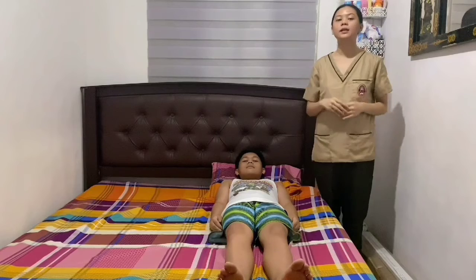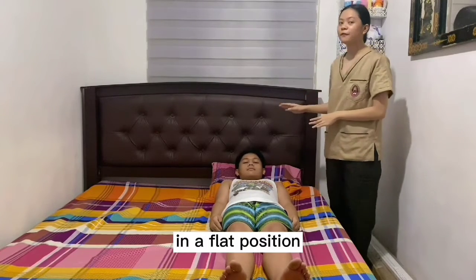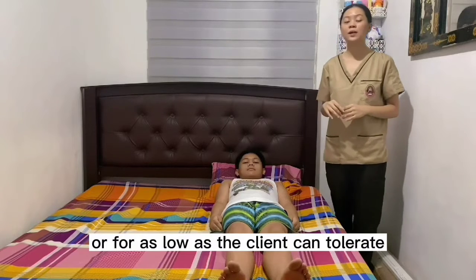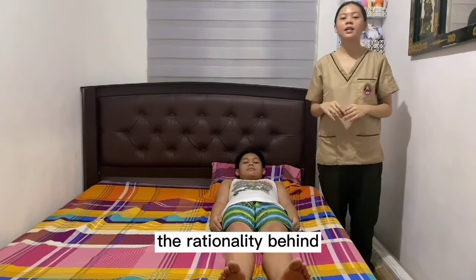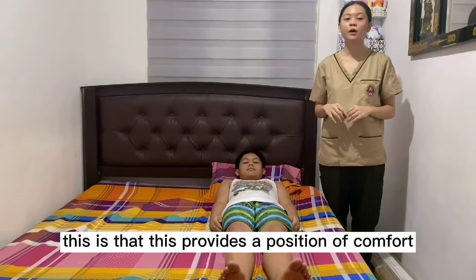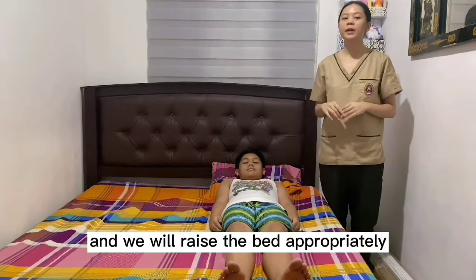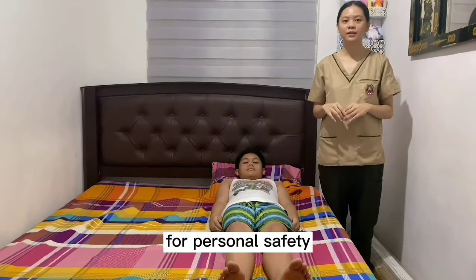of the bed. And we will now adjust the head of the bed to a flat position, or as low as the client can tolerate. The rationale behind this is that this provides a position of comfort for the client. And we will raise the bed appropriately for personal safety.